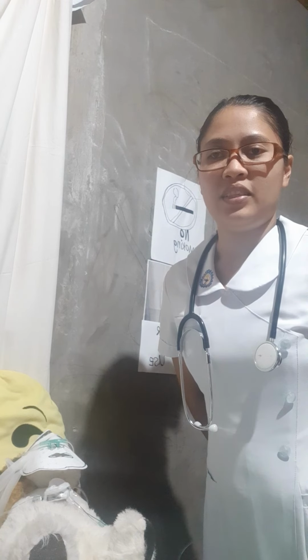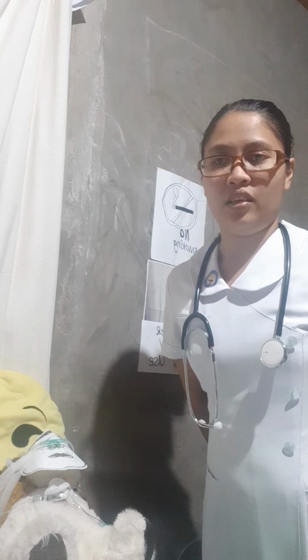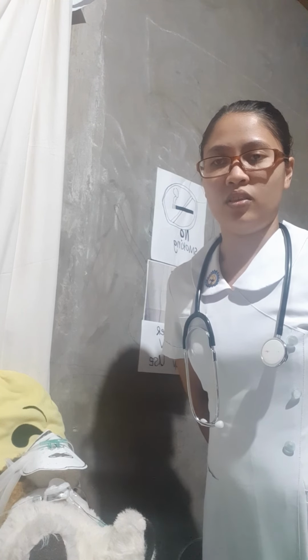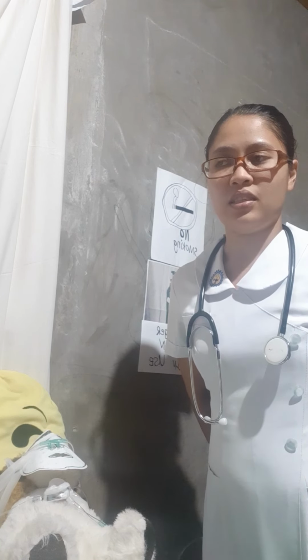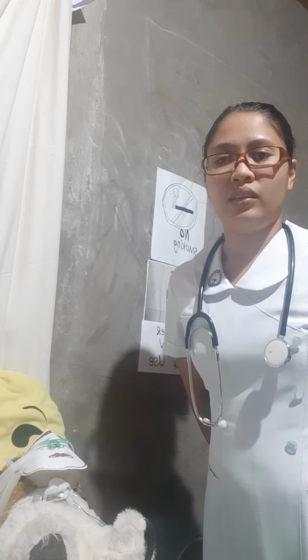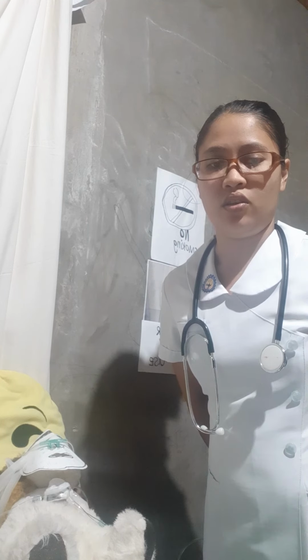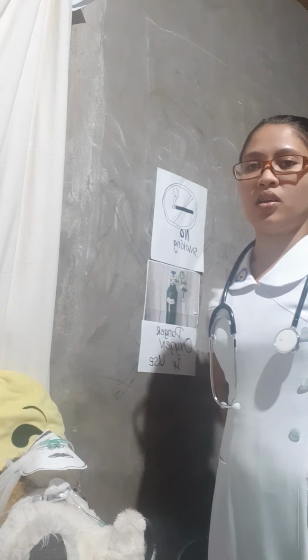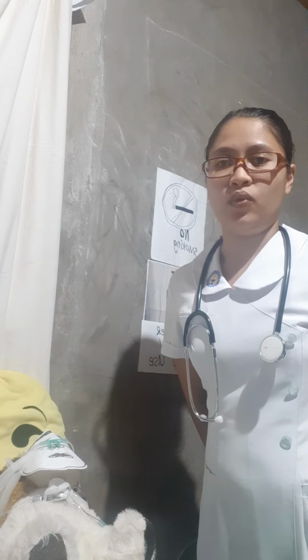Good day, ma'am. I am Chris Madaltayopon, your nursing aide for today, and I am going to demonstrate suctioning of nasopharyngeal and oropharyngeal airways. The procedure's purposes are to remove any secretions that obstruct the airways, promote ventilation, obtain some secretions for diagnostic purposes, and lastly, to prevent infection that accumulates from secretions. Next, for assessment, we need to assess the client's clinical signs indicating the need for suctioning.